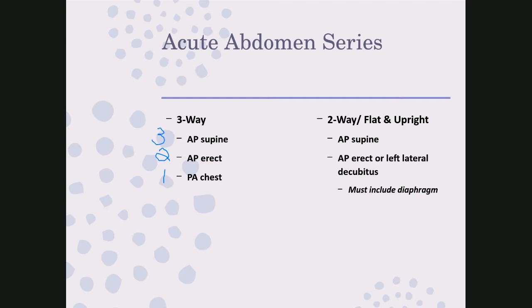If they were not ambulatory, then for non-ambulatory, you would first do an AP chest.